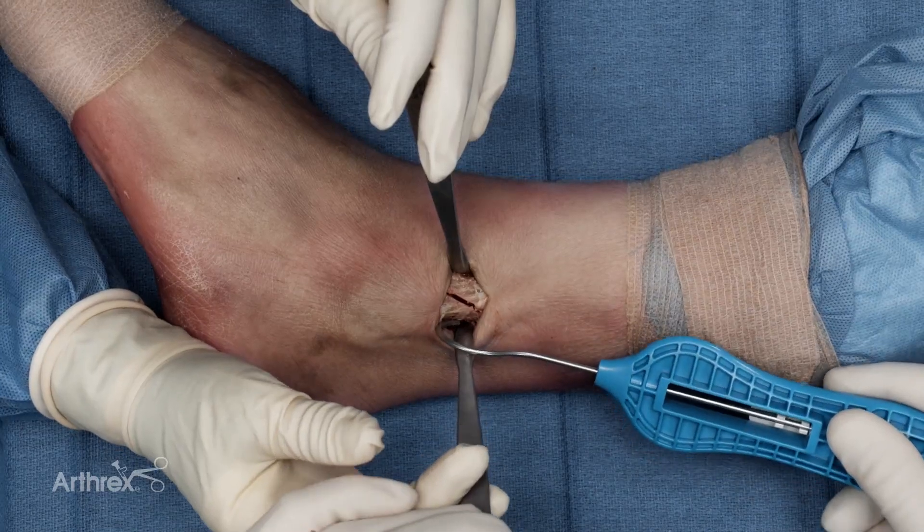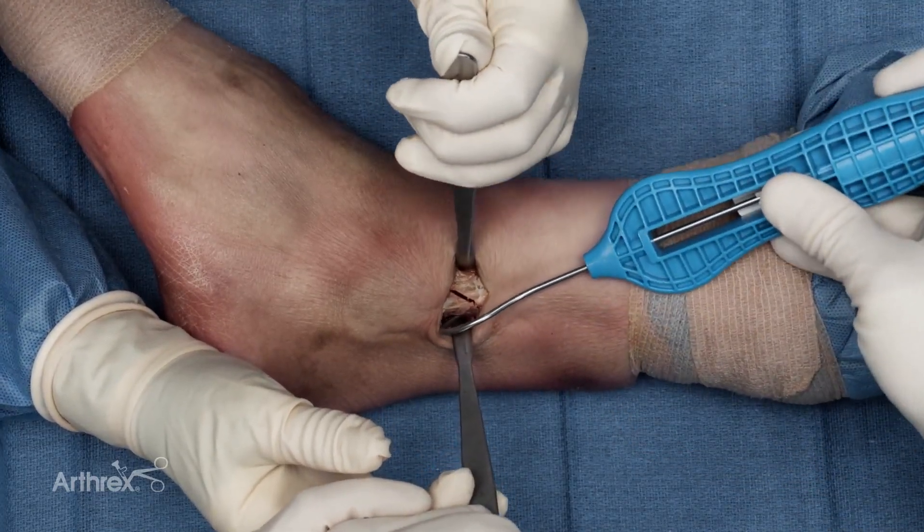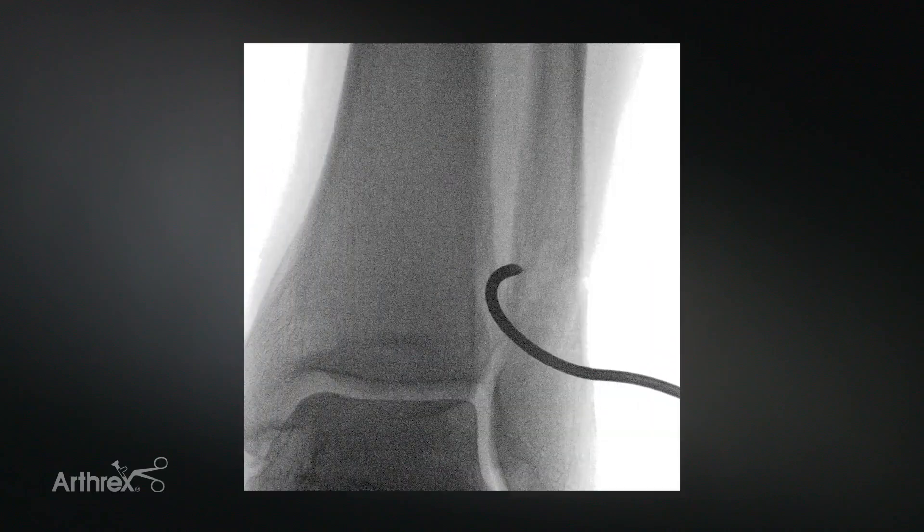Sometimes it can help to get your retractors out of the way or use a different retractor to facilitate passage. The disposable cerclage passer has now been passed from posterior to anterior across the fracture site. As you can see on the x-ray, the fiber tape cerclage passer stayed close to bone during the entirety of the passing around the fibula.